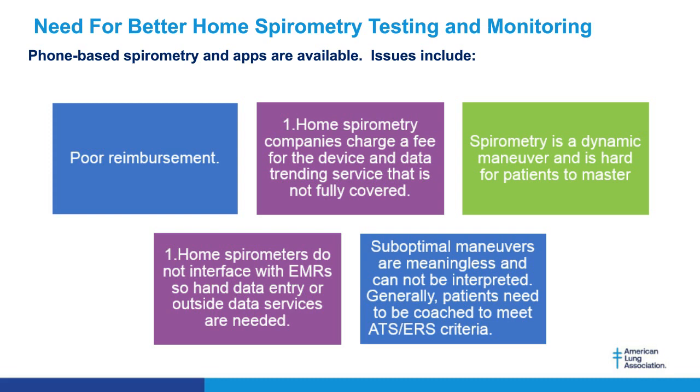There's also a problem: my doctors all want to have this go into the EMR. Home spirometers do not interface with the EMRs, with the medical records, and so the data entry is laborious, and it has to be hand entered from outside, or the doctor has to log into an outside service, some sort of cloud-based service, to look at the trend for that particular patient.